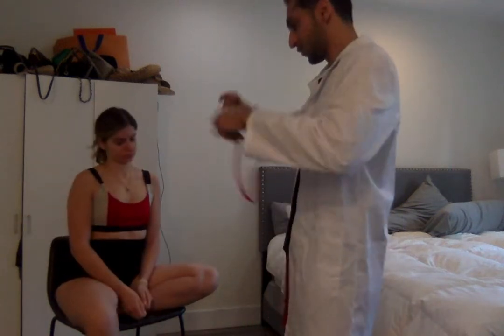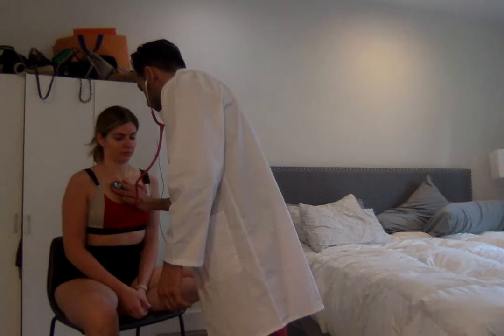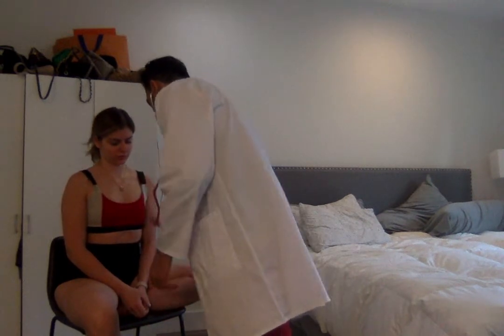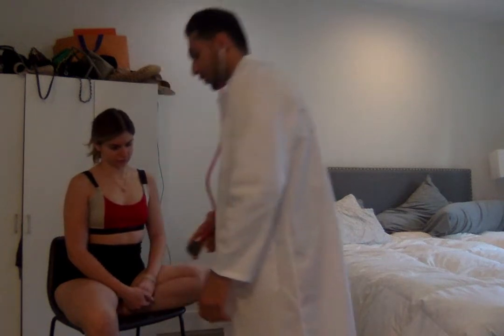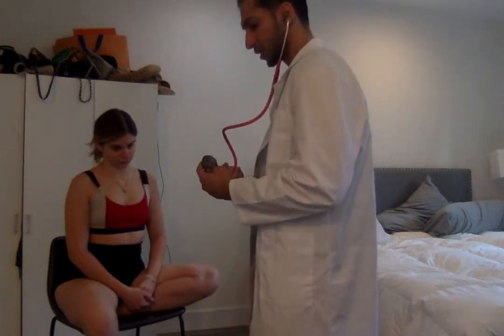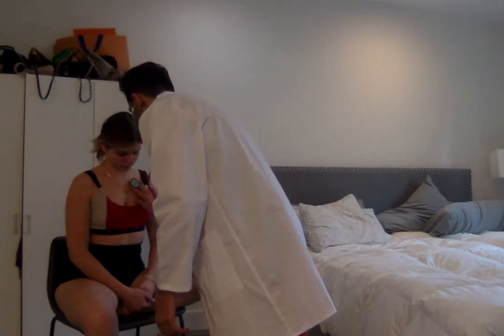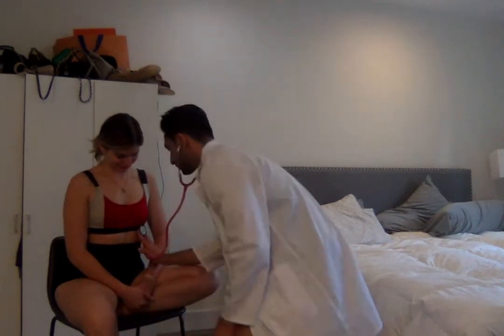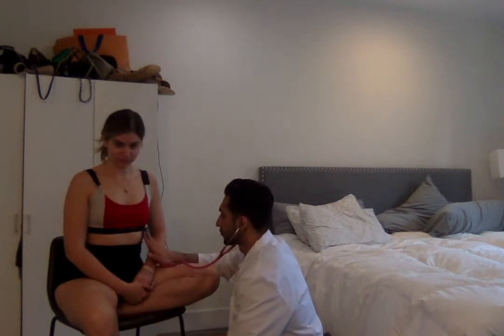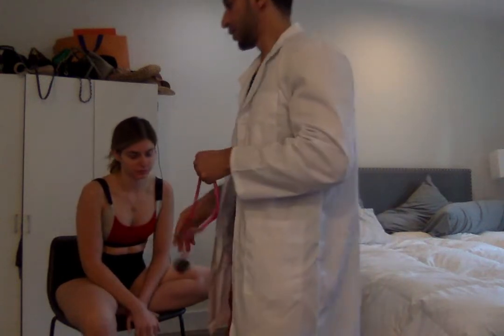So we're going to take a listen to that with the diaphragm first. All S1, S2 sounds. Now we'll take a listen using the bell. Okay, so no murmurs, no bruits heard, all that.